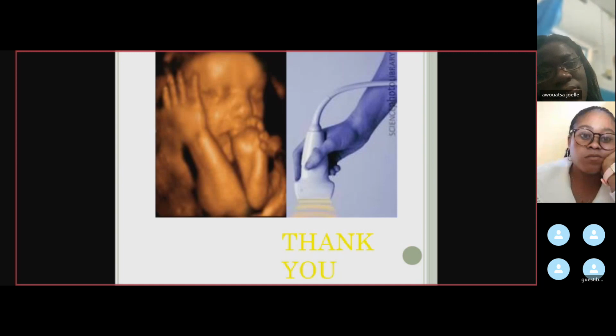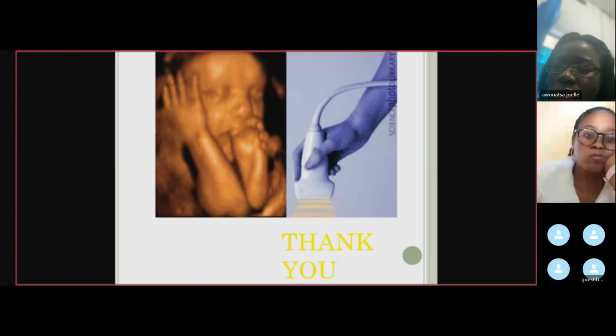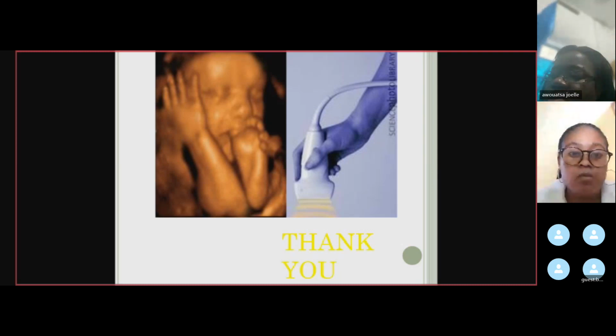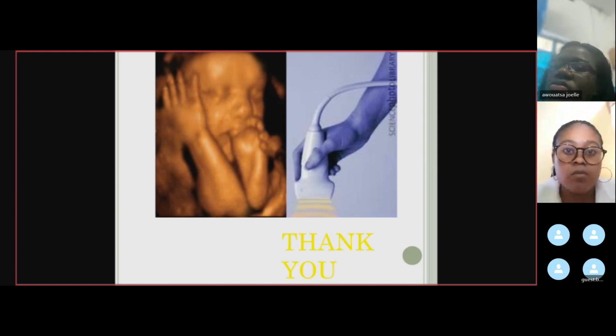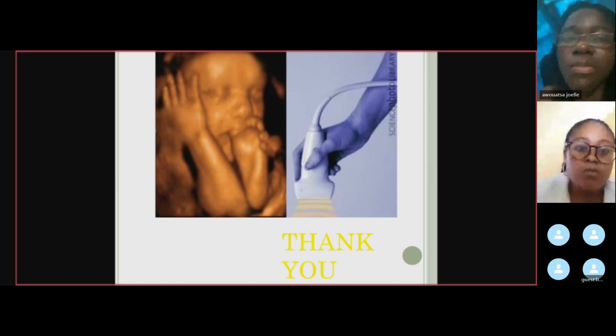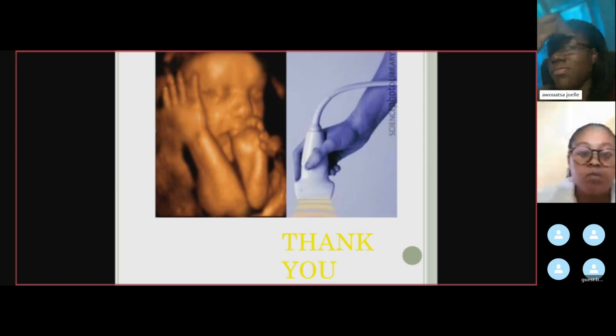Okay, so I was telling about bioeffects. Whenever an ultrasound beam enters the body, it can either get refracted, scattered, or absorbed. Whenever the ultrasound beam gets absorbed, this mechanical sound energy will be converted into heat. If we scan continuously, it will continuously get absorbed. Once it is absorbed, it will heat that area, and that can cause problems to the patient.